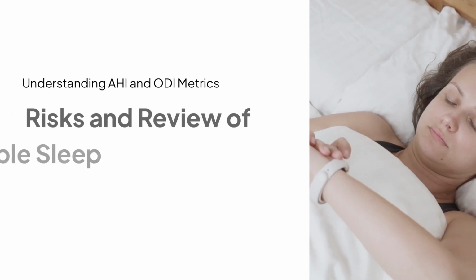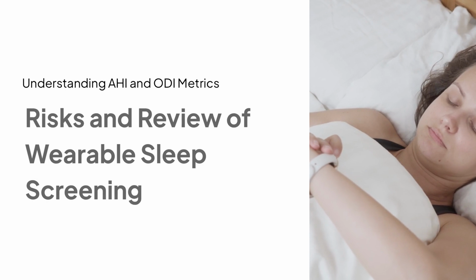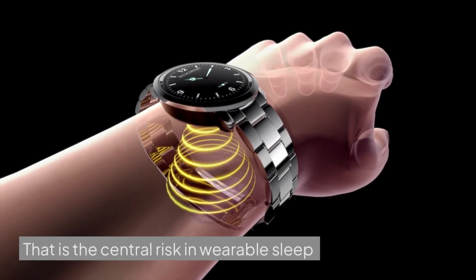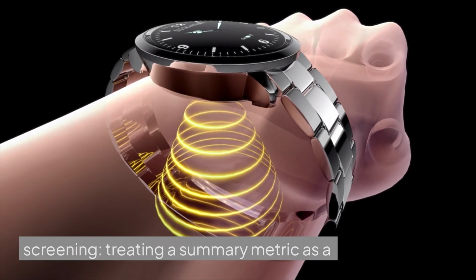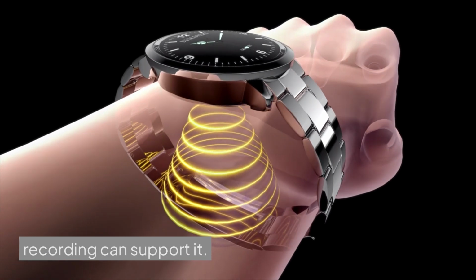An AHI or ODI value can look precise while resting on an incomplete night, a loose probe, movement artifact, or weak peripheral signal. That is the central risk in wearable sleep screening. Treating a summary metric as a conclusion before checking whether the recording can support it.